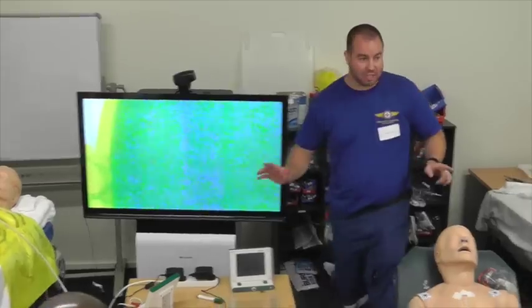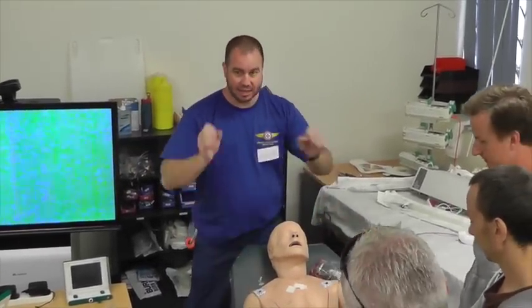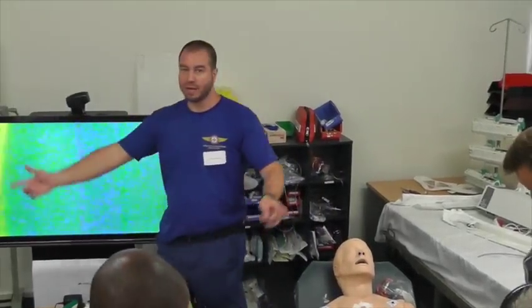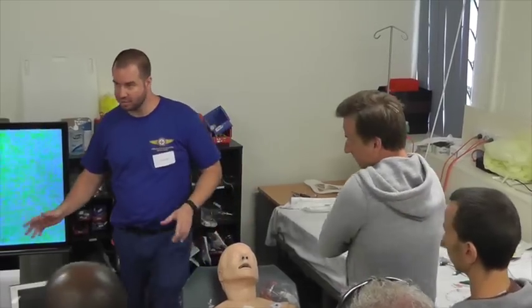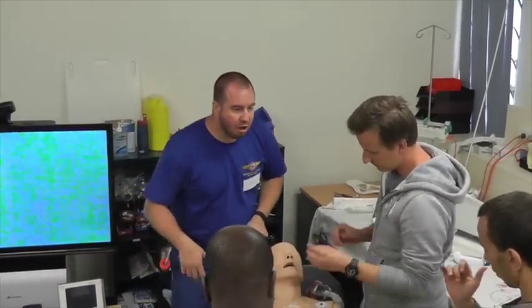Okay, so what I want you to do is break into two groups. I want you to get your hands on the kit, get involved, start using the stuff, develop the muscle memory, play with it, and then we're going to break off in a minute and we're going to advance this whole thing to the next level and talk about some tips and tricks, okay? So get your hands on, get involved.